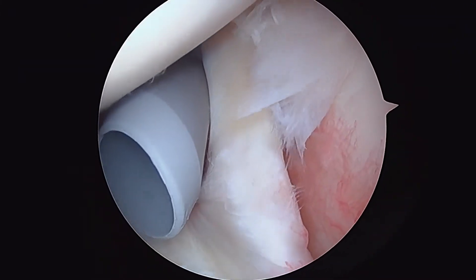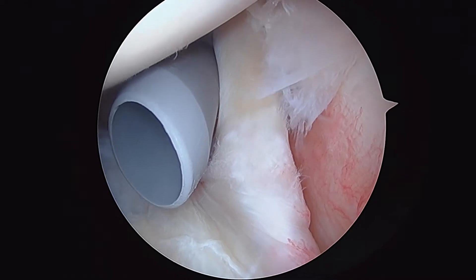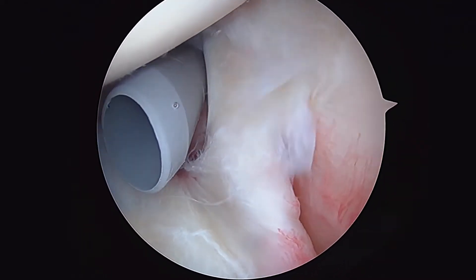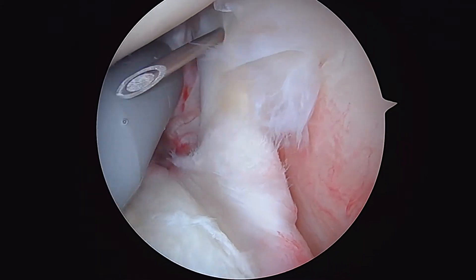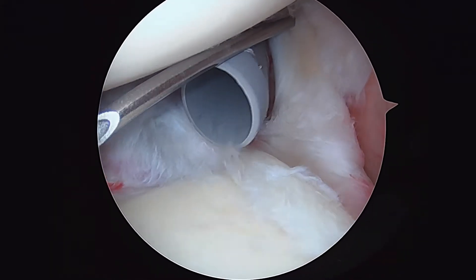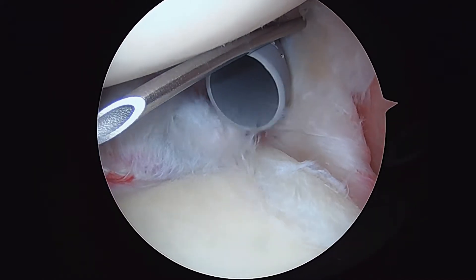We're going to take a spinal needle right now and pass that through. The torn tissue you see to the right of that is your rotator cuff tear right here. We're going to pass our needle through the biceps and do what's called a soft tissue tenodesis. We might incorporate it into an anchor for the tenodesis as well, but at least initially we're going to hold it by passing a stitch through.